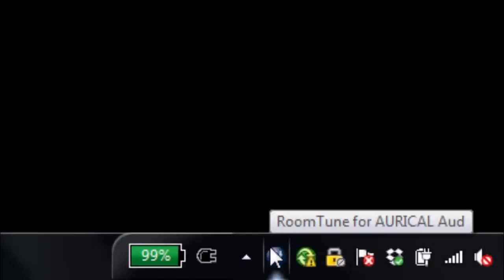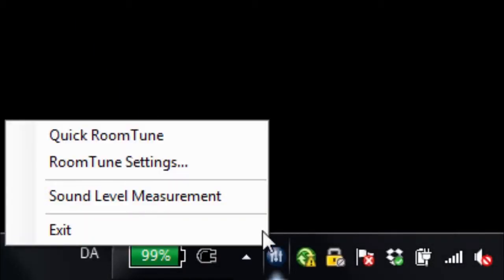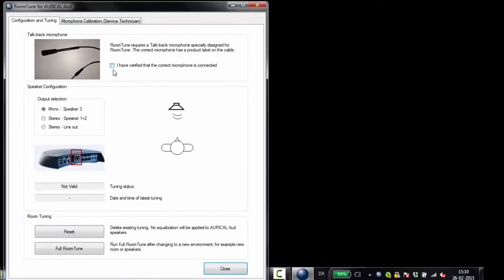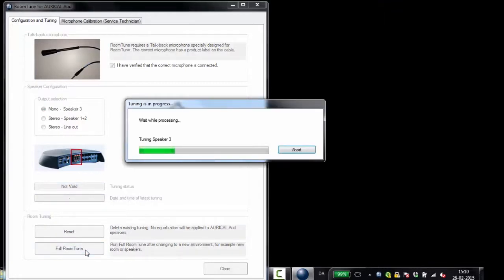To use Roomtune, just open the Roomtune tray application and enter the settings. Confirm that you have the correct measurement microphone, select the speaker setup, and start the initial Roomtune measurement with the measurement microphone in the listening position.